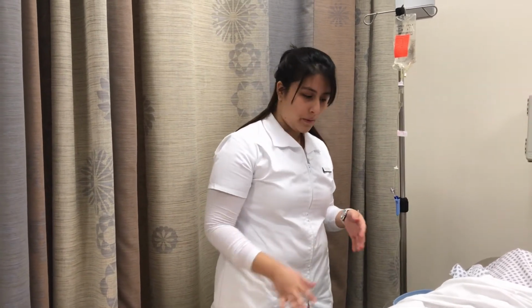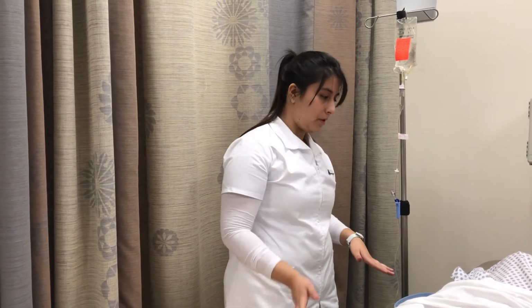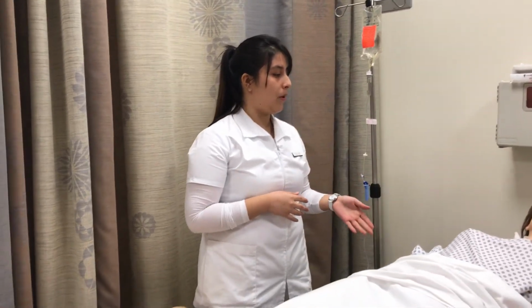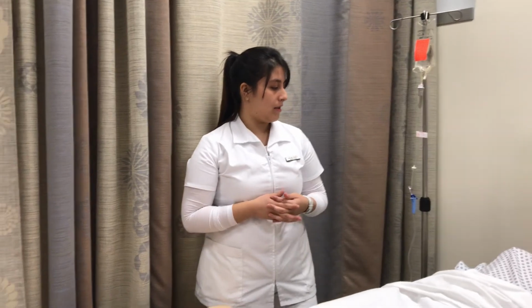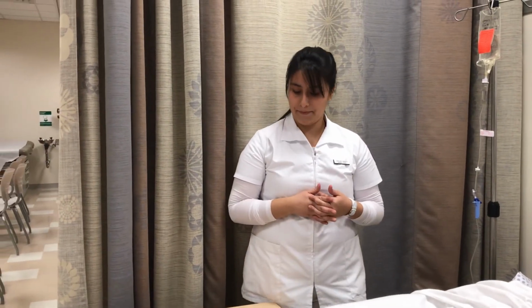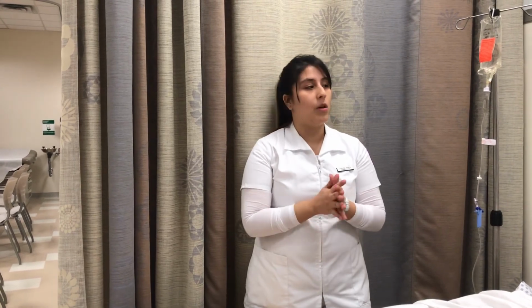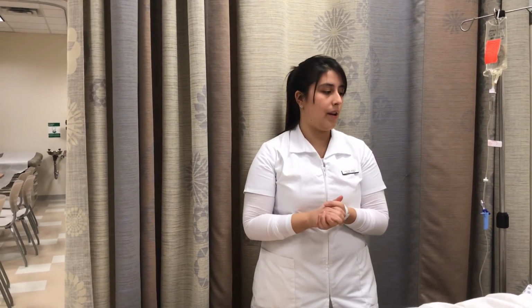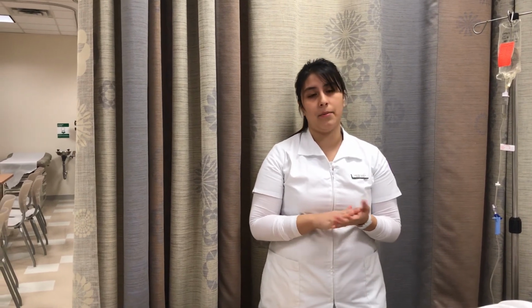And I will be making sure the patient is comfortable in a low position. Making sure they have the call bell if anything. And the railings up, in this case there's the railings. And I would wash my hands and record an I&O. And that is my validation on setting up an IV piggyback.